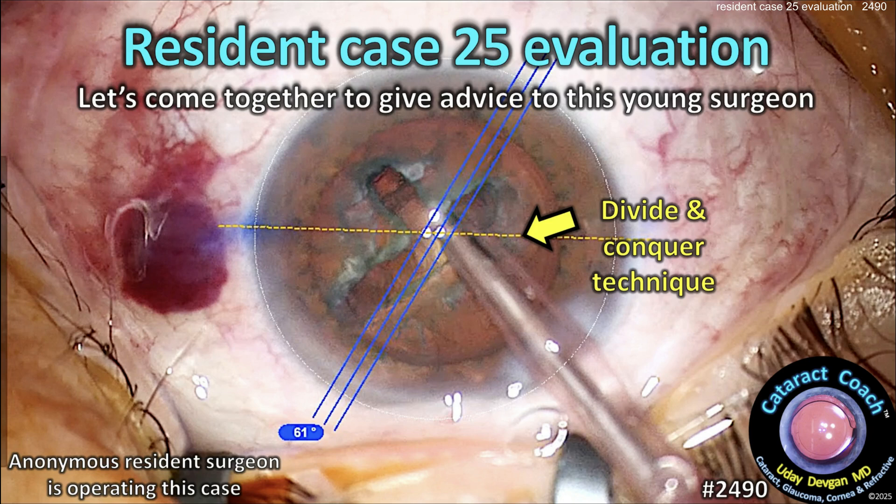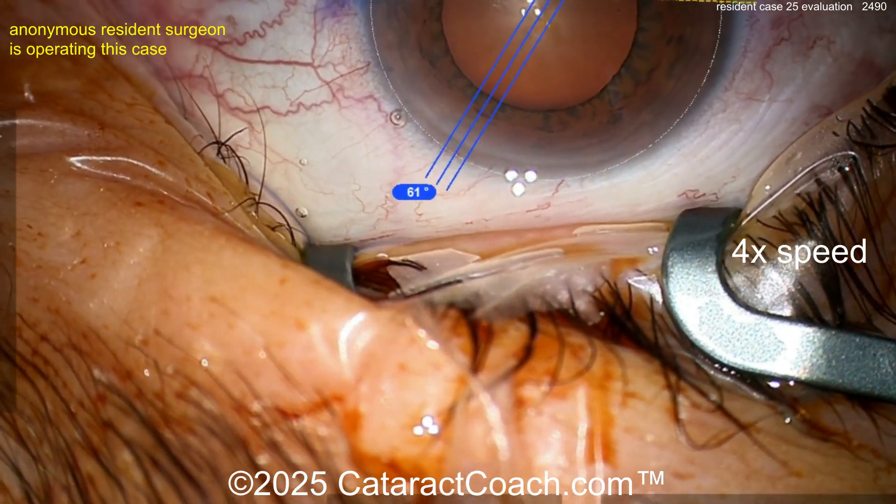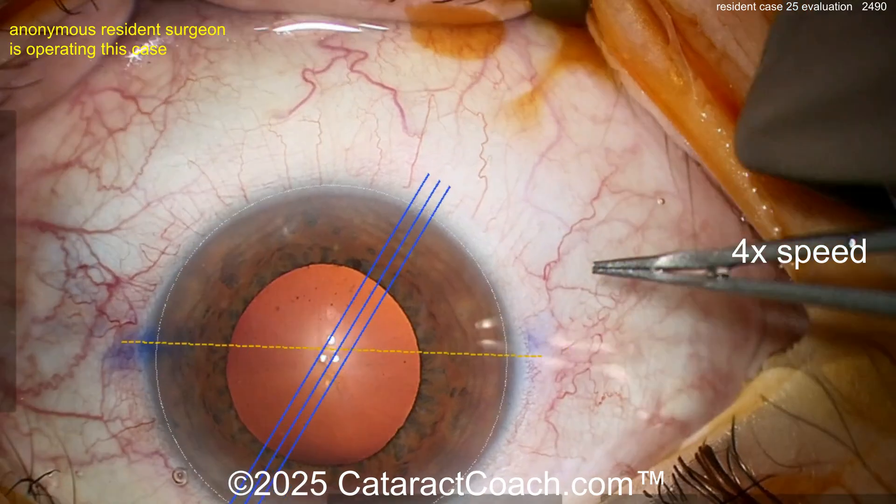CataractCoach.com resident case 25 evaluation. Let's come together to give advice to this young surgeon doing divide and conquer for case number 25 of the career. Now here we go — sitting superiorly, looks like pretty reasonable draping. You've got the overlay to show you the eye.